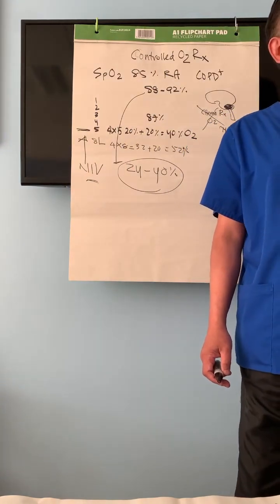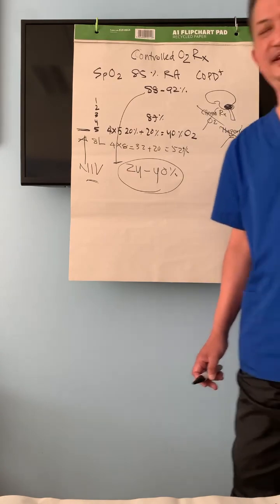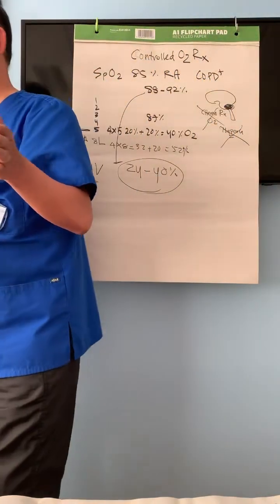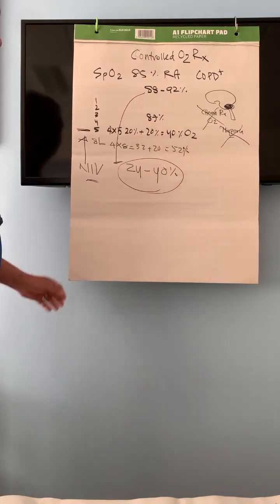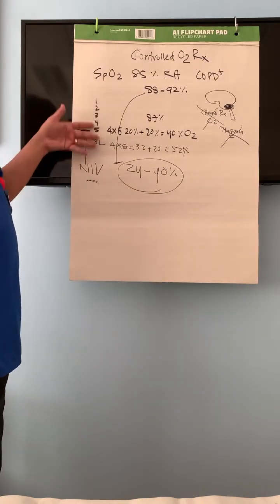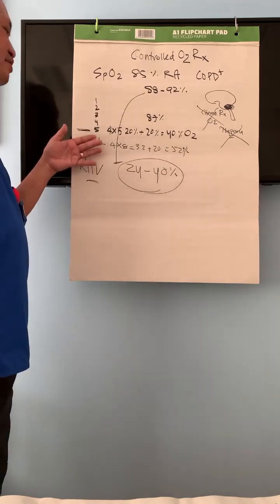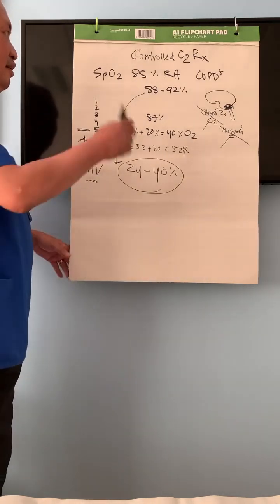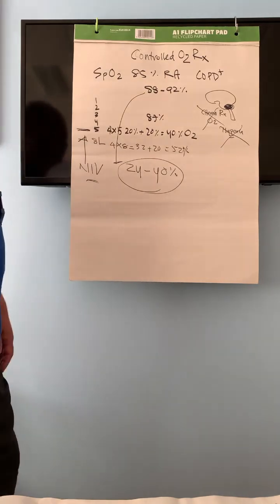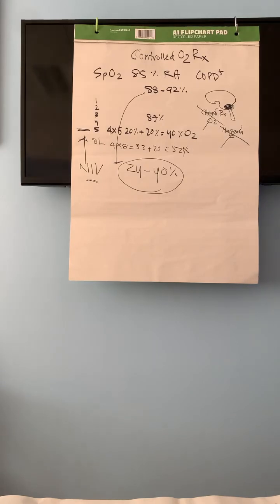There are blue, white, and yellow or something. There is a color coding system there. I couldn't remember today the percentages. Maybe the nursing staff might know better than myself. So controlled oxygen can be delivered with a Venturi, but we shouldn't use Venturi masks beyond green. So this is called controlled oxygen. After that, we will go into the non-invasive ventilator. Any questions until now?